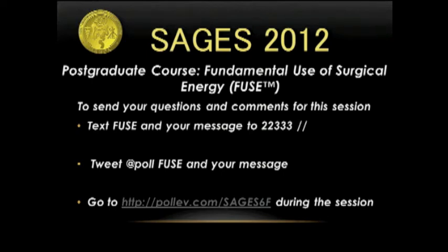You're doing a case and on the face a fire starts. Remember, first, turn off the oxygen. Number two, take the material off, and if it's the endotracheal tube, take the endotracheal tube out, and then care for the patient. So that's something that we don't get exposed to very much, and I think it's one of the very critical things that we're trying to teach here.